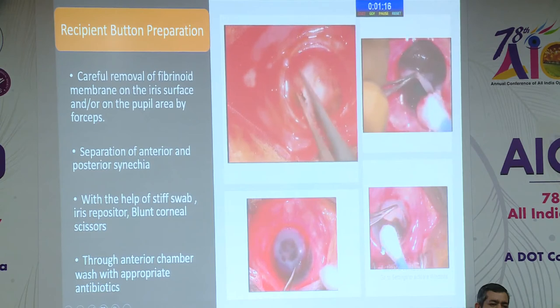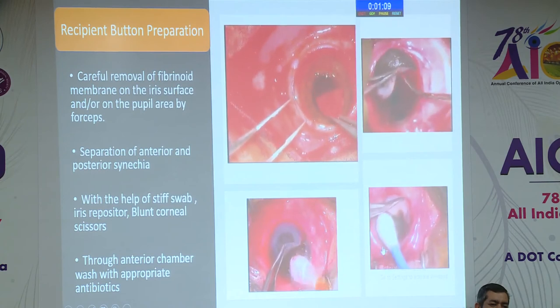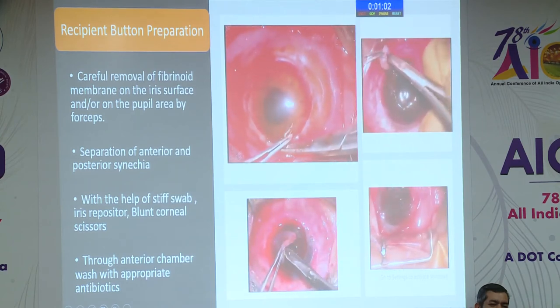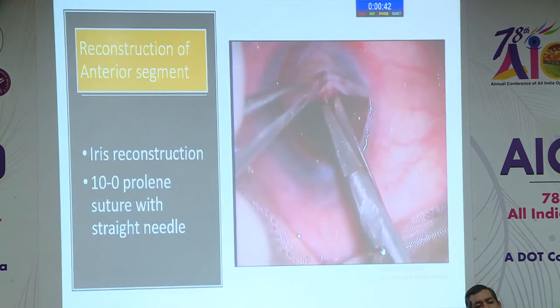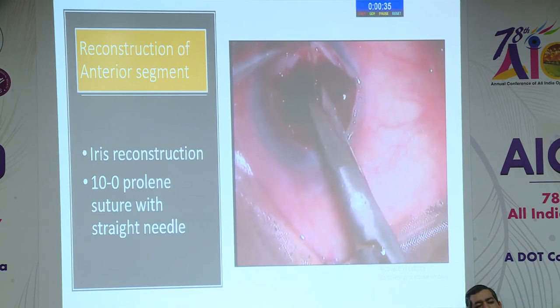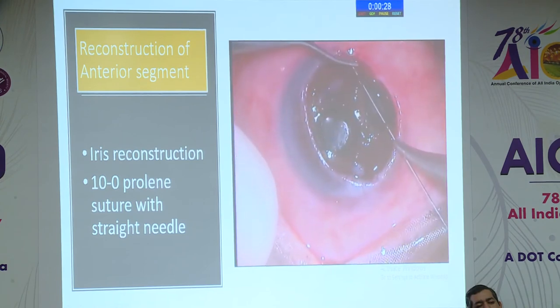The next step is recipient button preparation, and this can be done by various methods. In case of corneal abscess where there is a fibrinoid membrane, it can be removed from the iris surface and the pupillary area without damaging the lens and iris diaphragm, very carefully with a blunt instrument. Synechiae were removed with a stiff swab, iris repositor, and even a blunt corneal scissor. In infected cases, after removing the infected material, a thorough wash of the anterior chamber is given with appropriate antibiotics. Many times while removing the synechiae, there is distortion of the iris, which requires iris reconstruction, as you are seeing in this case. We can reconstruct the iris with a 10-0 Prolene suture, which has a straight needle.